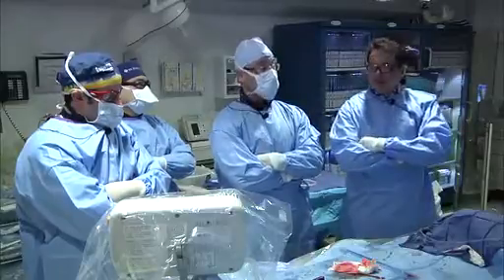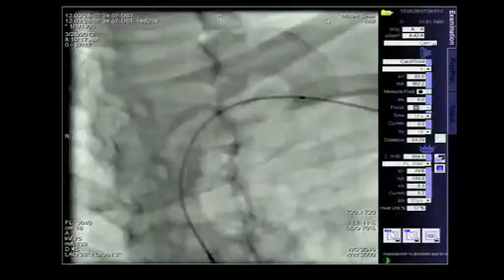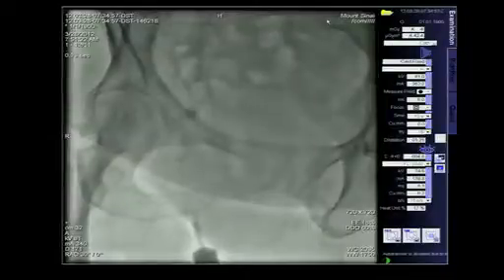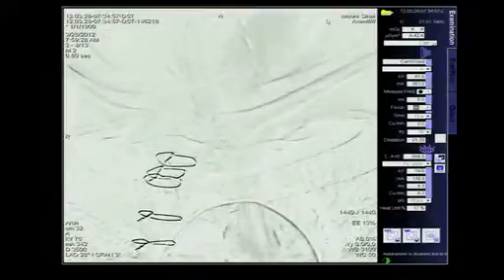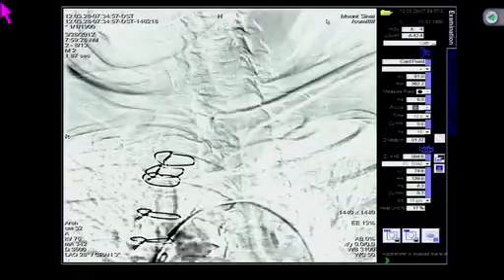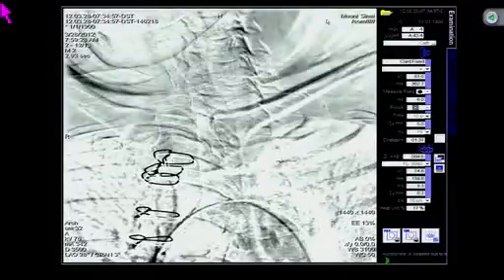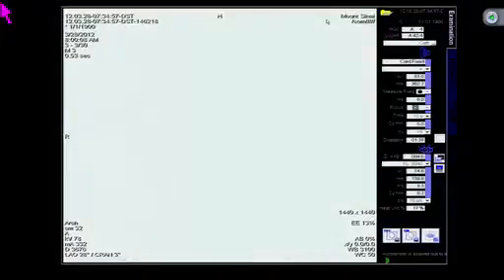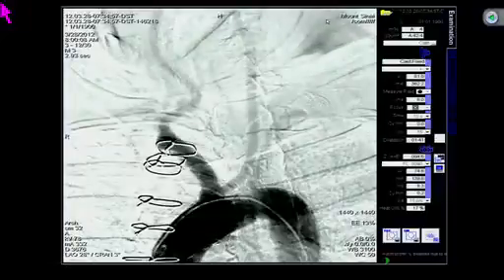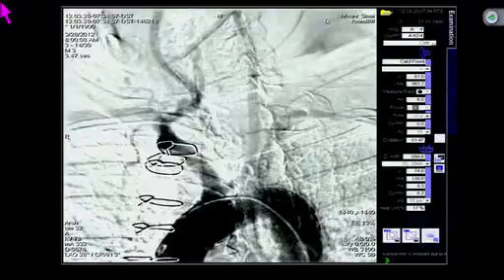But let me get right to the angiographic findings here, and I want to start with the technique of how we do things so we get it right. Obviously, access in the groin. I don't know if you can put up the thing. As you can see, we did an aortogram here, an arch aortogram, which is really not showing up very well. It seems like, let me see on this one. Here we go. Maybe this one will show up a little better. There it is. So you can see here, we did an arch aortogram, and it's essential for everyone out there who's going to attempt this type of intervention to start with an arch aortogram.